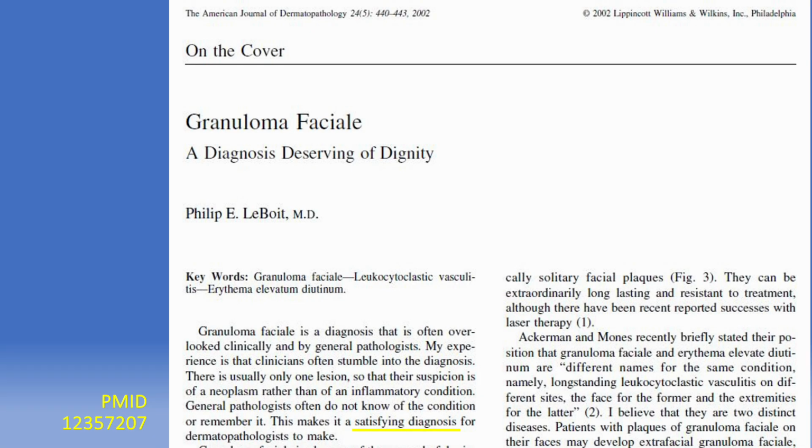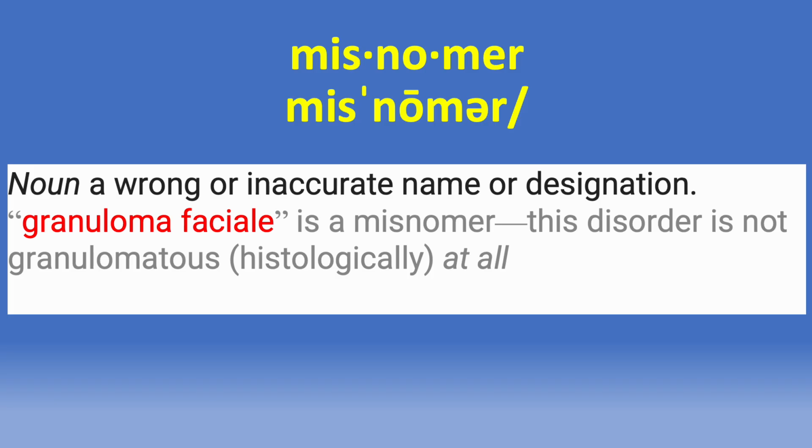A diagnosis deserving of dignity and also quite satisfying for the dermatopathologist. And a complete misnomer histologically in that the disease is not characterized by granulomatous inflammation at all. In this case, the term granuloma in granuloma faciale refers to the clinical appearance resembling other truly granulomatous disorders.